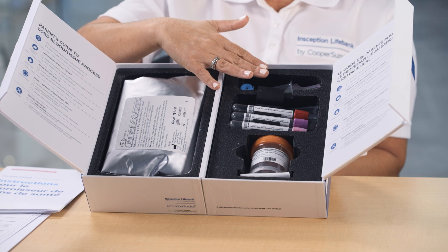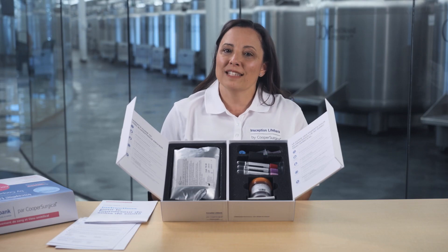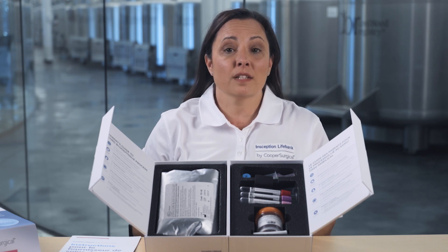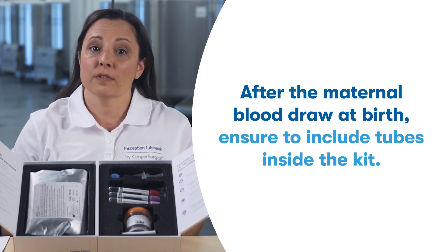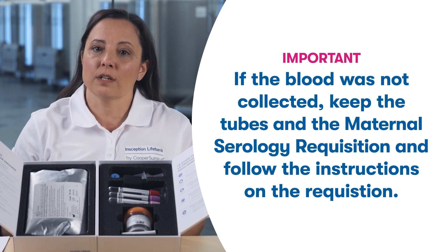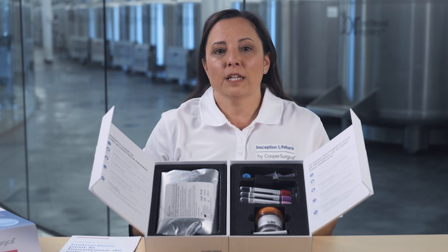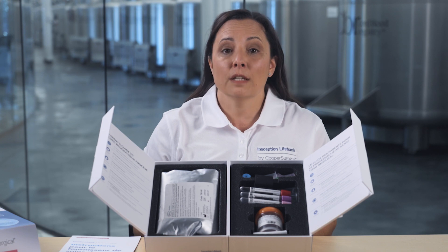These last items here are your maternal blood collection tubes. There might be condensation inside the tubes — that's normal. It's very important that the hospital staff understand that if the collection is done at the birthing facility, the tubes need to be included in the kit with your baby's cord blood and cord tissue. If your maternal blood is not completed at your birthing facility, be sure to keep the tubes and the maternal serology requisition as explained on the requisition. If we do not receive your maternal blood tubes at our laboratory for testing, you may not be able to use your baby's newborn stem cells in the future.